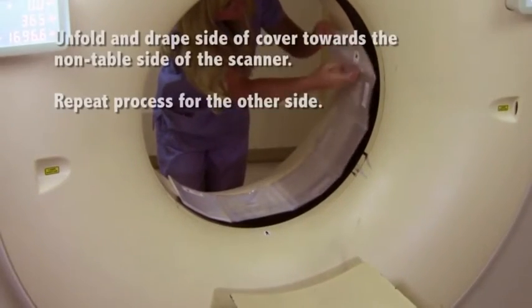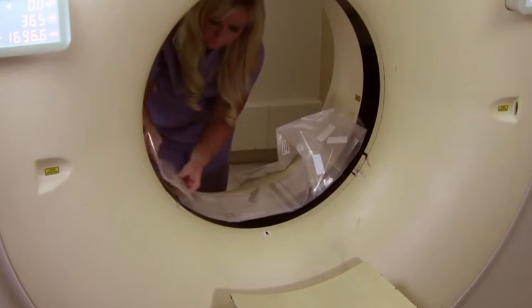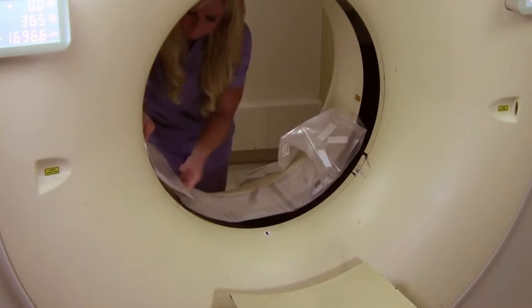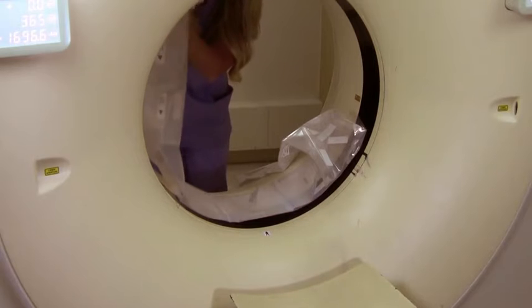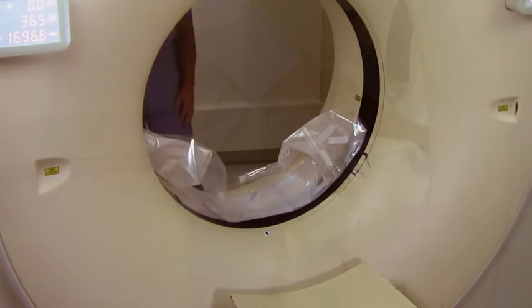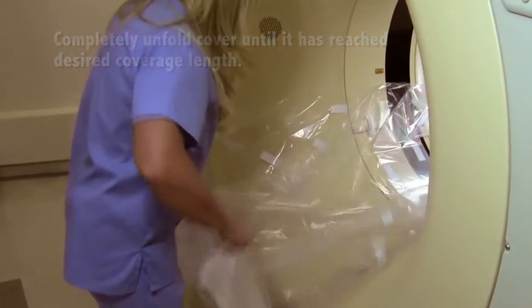Unfold and drape the side of the cover towards the non-table side of the scanner. Repeat this process for the other side. Complete the cover to the non-table side of the scanner until it has reached the desired coverage length.